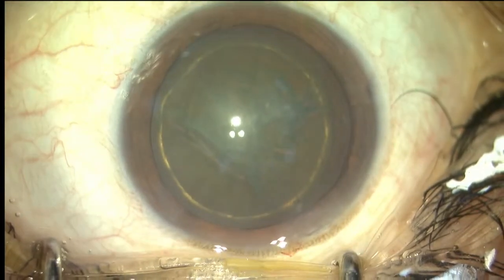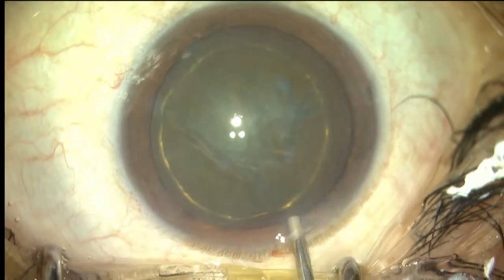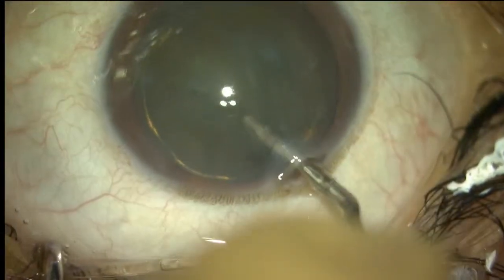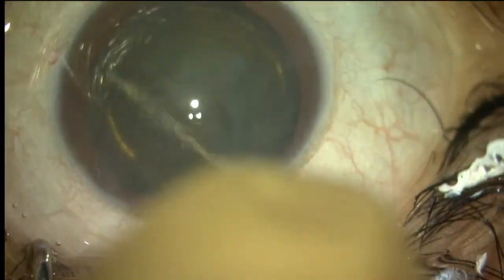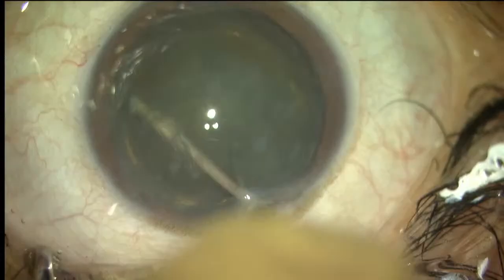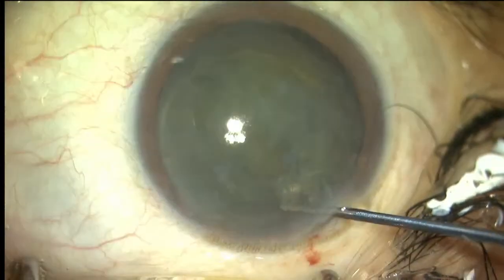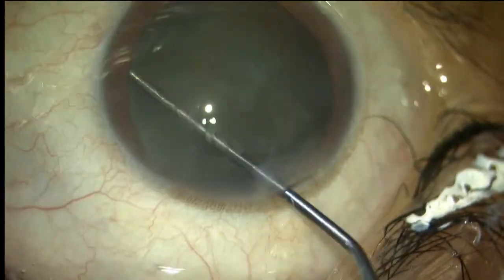Give me the visco. A bit of visco dissection. It is always better to do a bit of visco dissection, because then you can completely separate the nucleus and the cortex so that you have a free nucleus. So you can see the nucleus is fully rotated now.